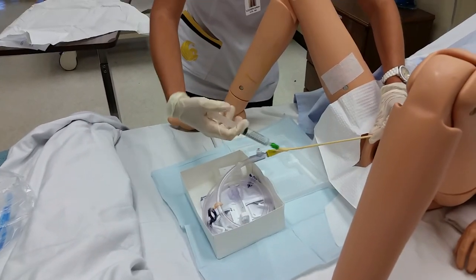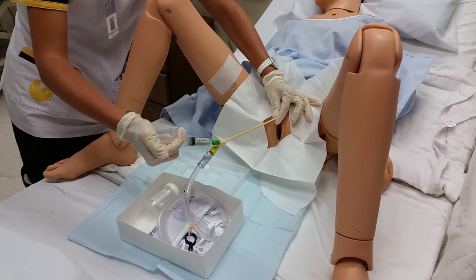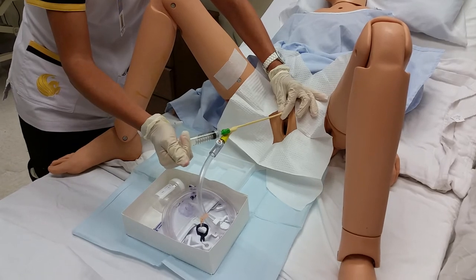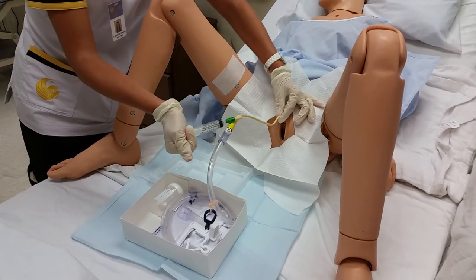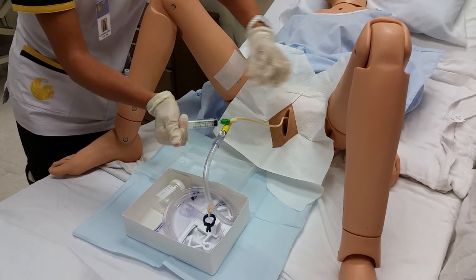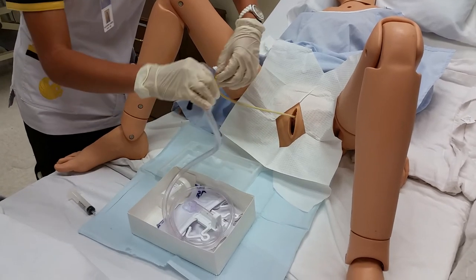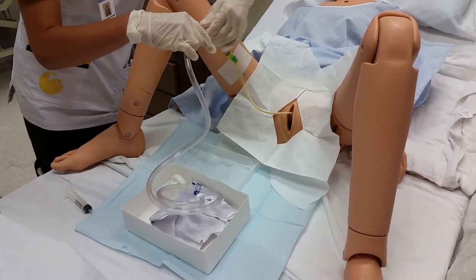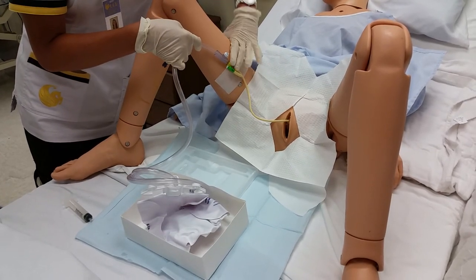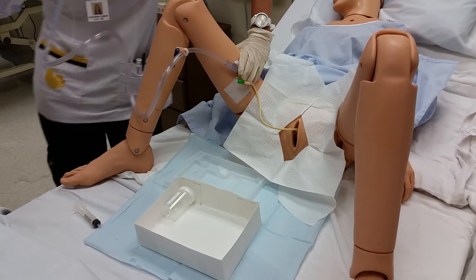I'm going to push my saline to inflate the balloon. I'm gonna hold on to this and go ahead and tug to make sure it's secure. It's secure. Go ahead and remove this. And then I would attach this to our patient's leg, making sure there's enough slack so in case it moves, it's not painful.